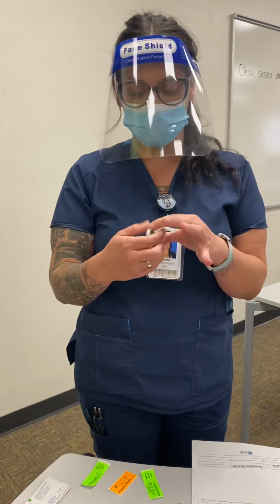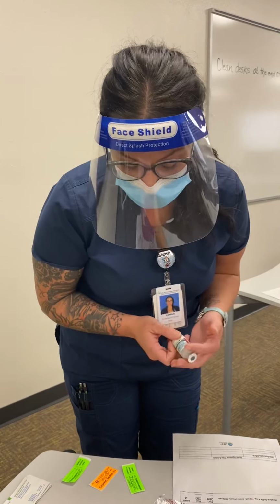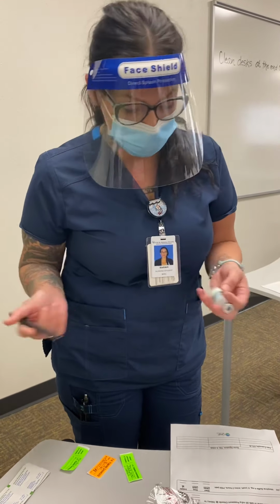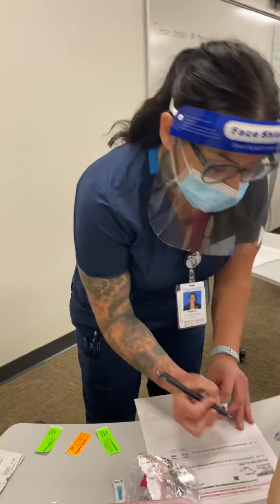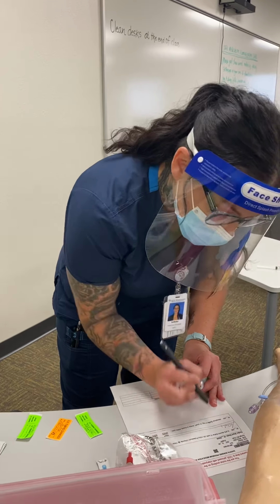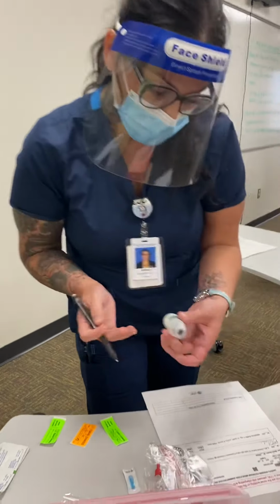I'm going to pull it out of the Pyxis and do my first med check. First I'm going to get my potassium chloride. I can see that it's the correct med, and available is 40 milliequivalents per 20 mils. The doctor's ordered 20 milliequivalents. I know with my dimensional analysis that I need to withdraw 10 mils of this medication. I'm just going to write that down. So there would be 20 milliequivalents per 10 mils. All right, that matches.